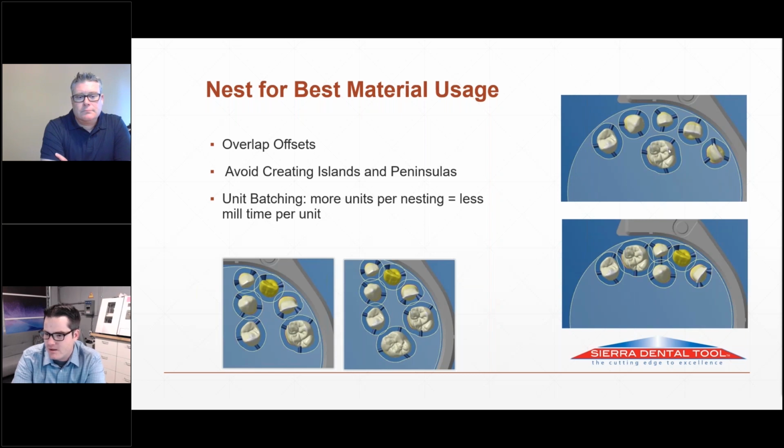When compared to a single, let's say a single takes 25 minutes to mill. If you mill 6, 7, 8 units together, your per unit mill time will be 23 minutes because there's gains there for batching. So top tip here, get the mill running, keep it running. Your mill's down, your wallet's down. And then batch strategically. If I've got two A2 cases or 7 A2 cases, don't do it in two batches, put them together.